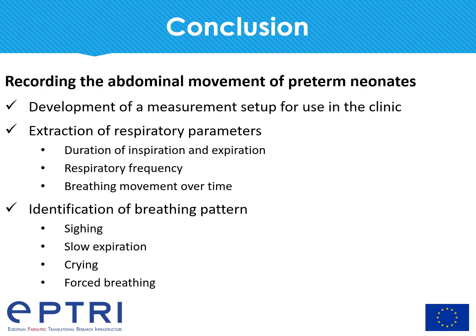To summarize the aforementioned work, we developed a measurement setup to record movement data in preterm neonates, which was usable in the clinic. We then recorded the preterm neonates and extracted the respiratory parameters. We were able to extract the duration of inspiration and expiration, the respiratory frequency, and the breathing movement over time. We were also able to identify various breathing patterns like sighing, slow expiration, crying, and forced breathing.